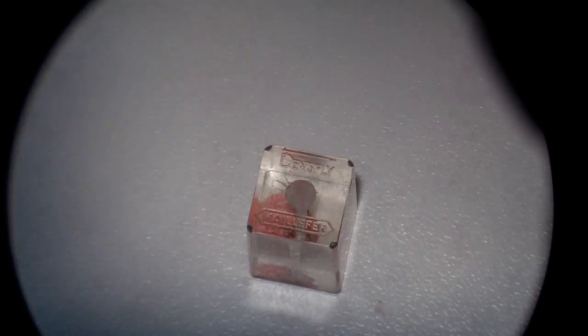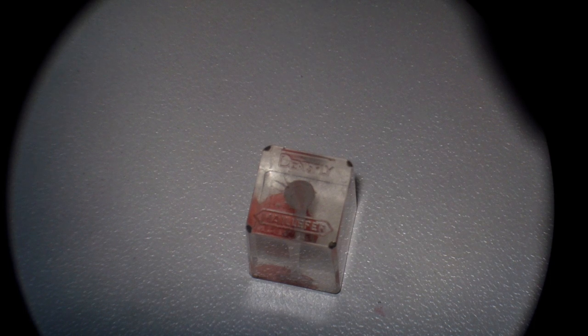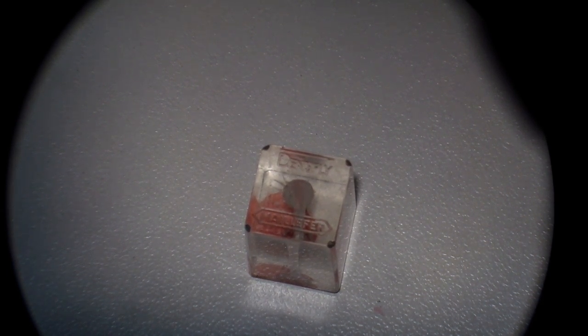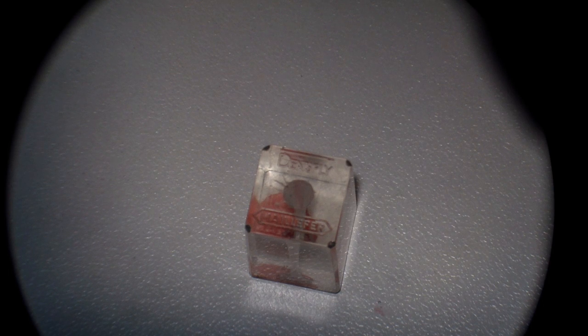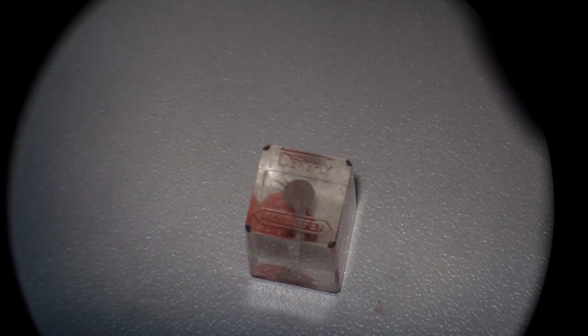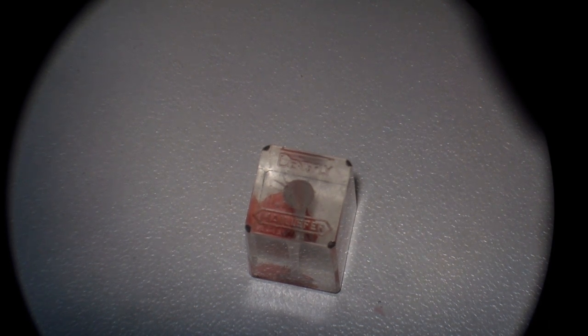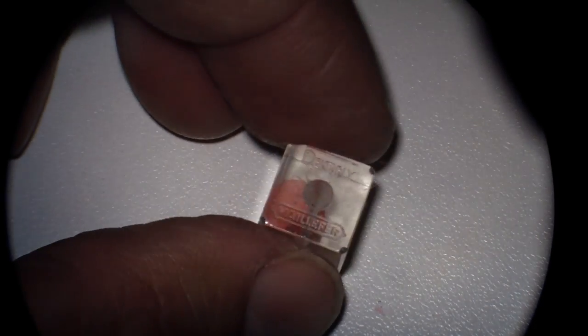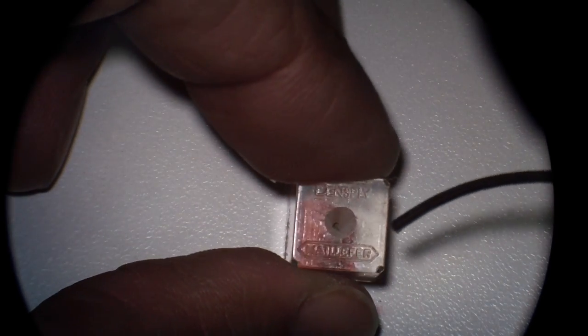So first things first, after preparing the canal in your typical fashion, I'm not going to talk about, it's important to remember that apart from doing the technical portion of doing dentistry, the biology is extremely important. You can do the best technical job possible, but if you're not paying attention, the biology may be off on the wrong way.